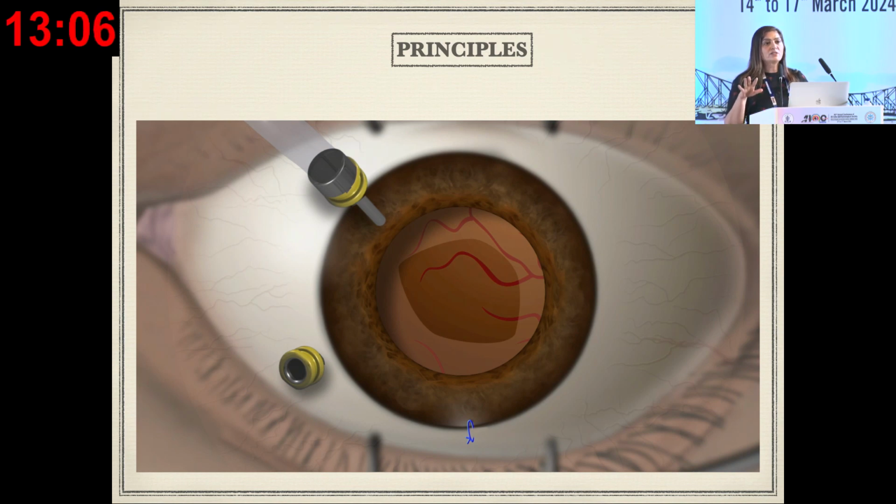Now, taking into consideration that you may not know how to put a trocar, that's fine, not everybody knows it. But the point is, you just take a vernier caliper, 3 millimeters from the limbus, and create a sclerotomy. Nothing will happen. From the sclerotomy, you can introduce your vitrectomy probe, do the vitrectomy, and then take one suture at the sclerotomy site and you are done. There's nothing much more to be done. This is one of the basic things that should be taken into consideration.